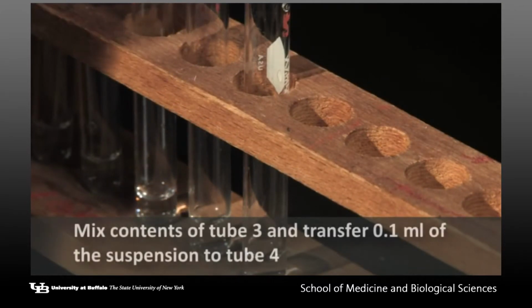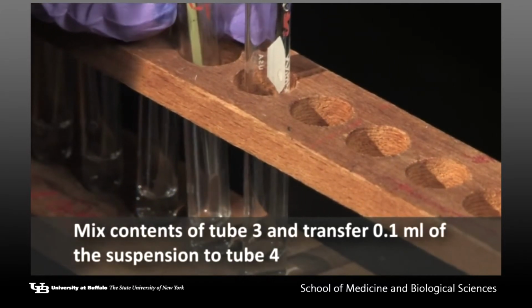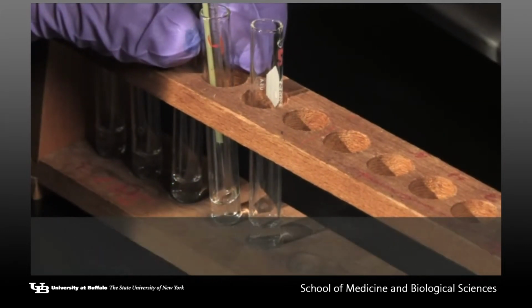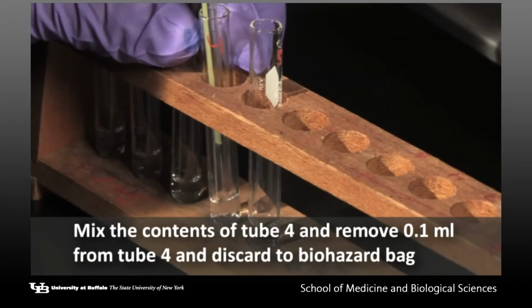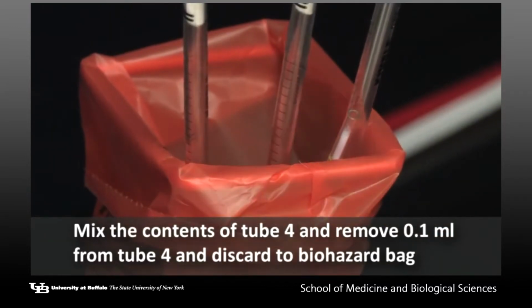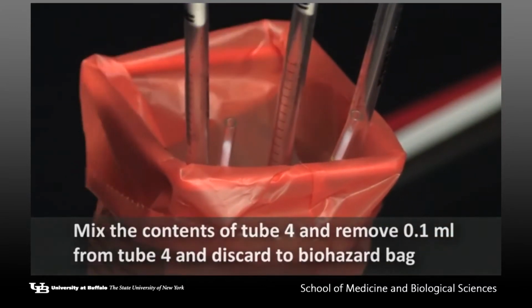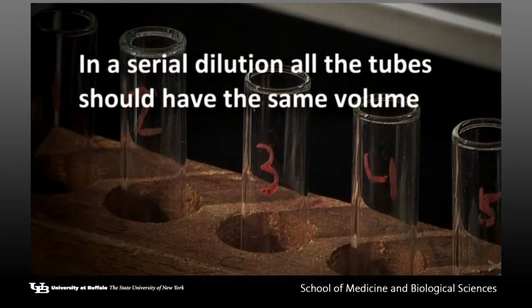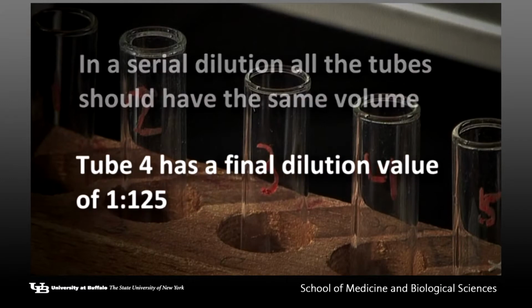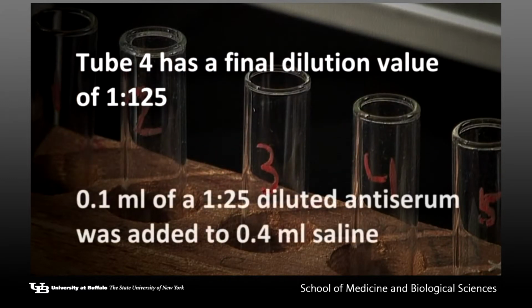Again, mix contents of tube number 3 thoroughly and transfer 0.1 ml of the suspension to tube number 4. Mix the contents of tube number 4 thoroughly and remove 0.1 ml from tube number 4 and discard the contents with the pipette in the biohazard bag. In a serial dilution, all the tubes should have the same volume. Tube number 4 has a final dilution of 1 to 125, since 0.1 ml of a 1 to 25 diluted antiserum was added to 0.4 ml saline.